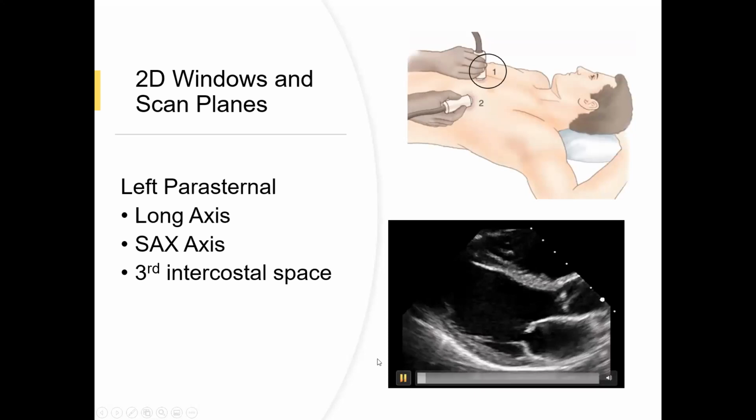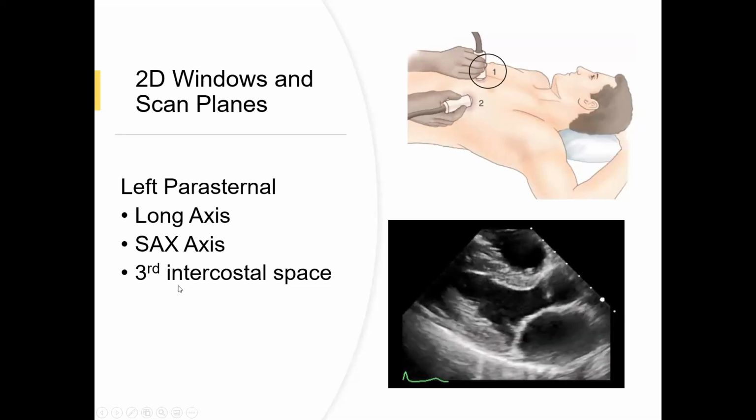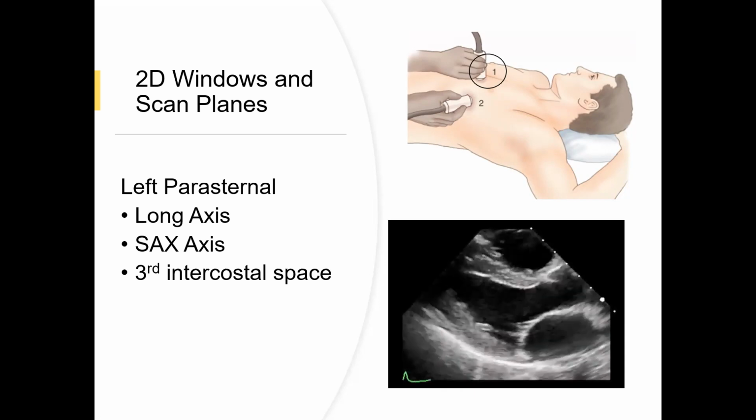And of note, the standard position for the parasternal long axis is usually about the third intercostal space. I mentioned that because in a minute we'll talk about doing aortas, the ascending aorta, and you have to move up an intercostal space, so that would be usually second.